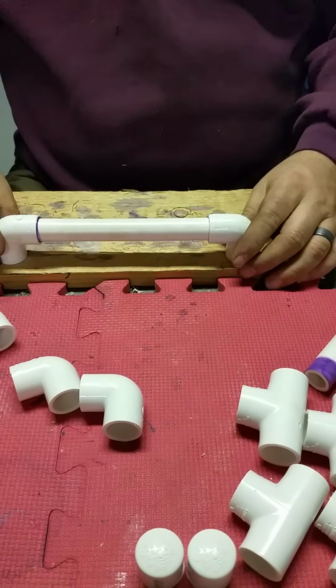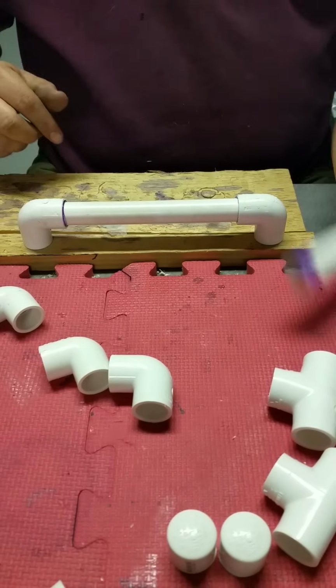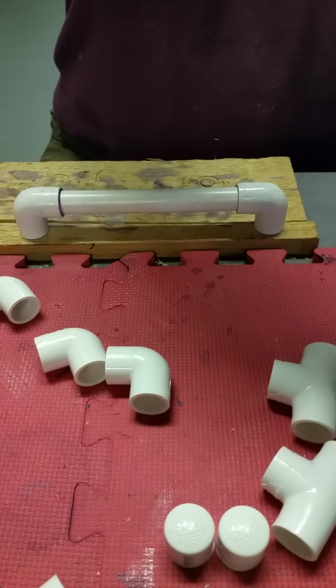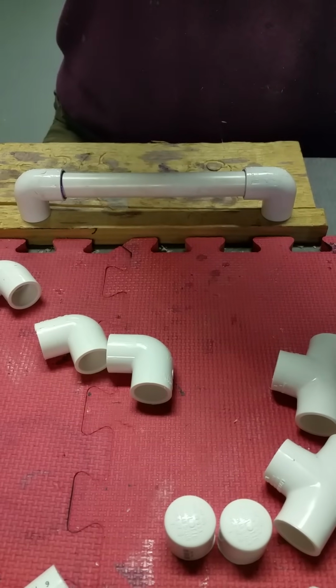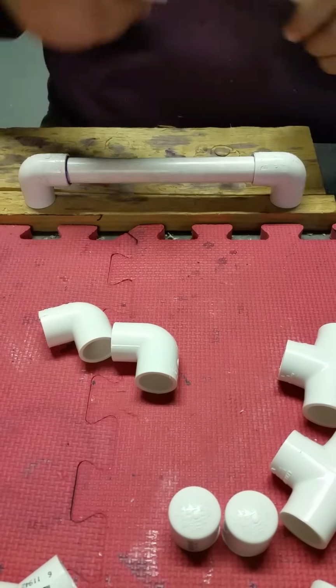This is the important part, that before that glue dries, within a few seconds, you have verified that it sits flat and that the pieces are straight on a flat surface.